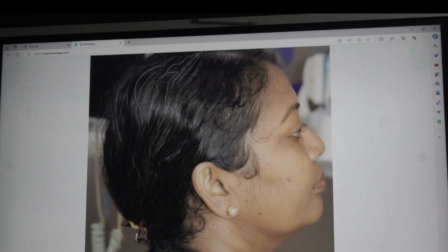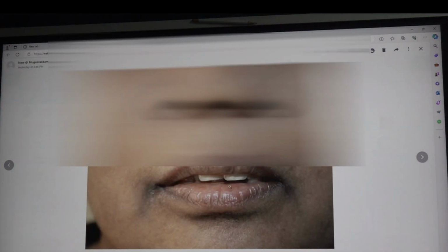So NHP, right? Natural head position. Just read up on how to bring the patient to the natural head position. Mild proclination is there. We don't know after surgery whether the patient expects the same proclination or wants the teeth to go back. Okay, see, we can see the mild lip incompetence is there.